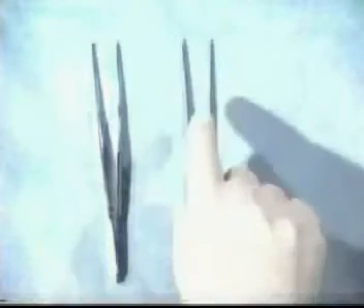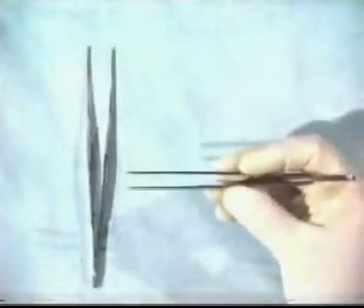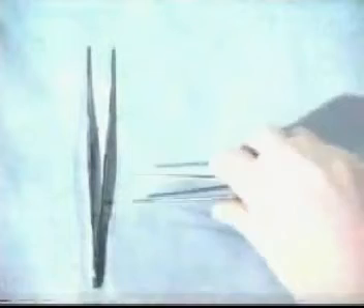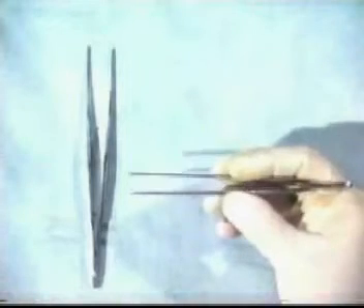There are two basic types of forceps: the non-toothed and the toothed. Toothed forceps are often used for tough tissues such as skin, while non-toothed forceps tend to be used for more delicate tissues such as bowel. Hold the forceps as demonstrated — not grasped in your fist. By holding them gently, you get accurate control of the tips of the forceps.